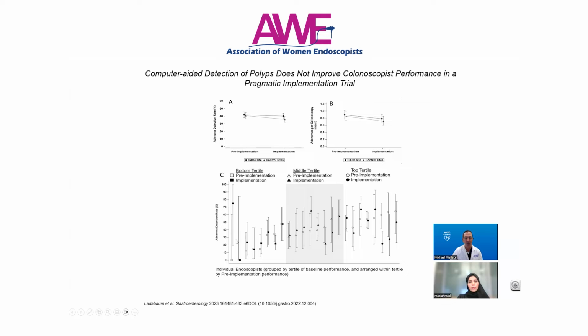across the range of endoscopists. Although if you look numerically in the lowest third, you generally did see a slight increase in most of those users between pre and post implementation. And similarly, a bit of a scatter for post implementation, but those that really had the very highest adenoma detection rate clearly didn't get much higher with the technology.